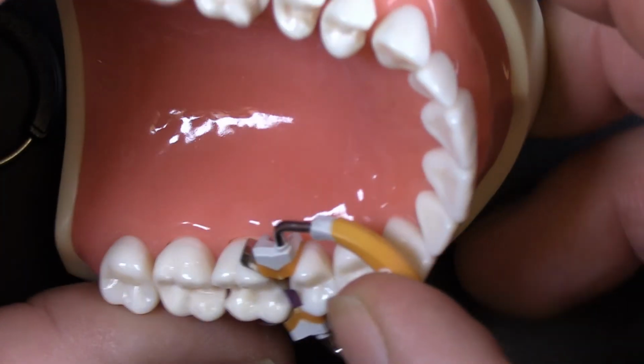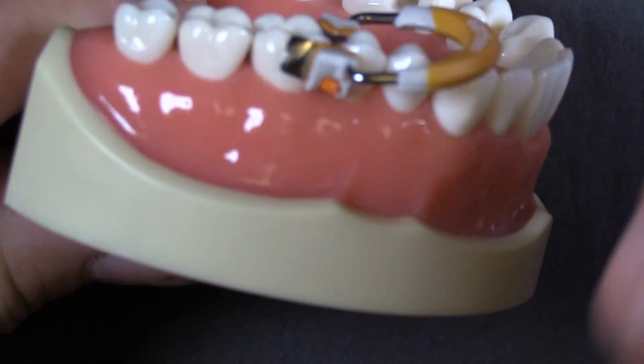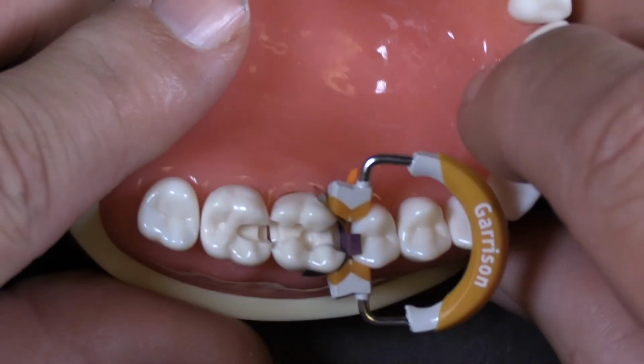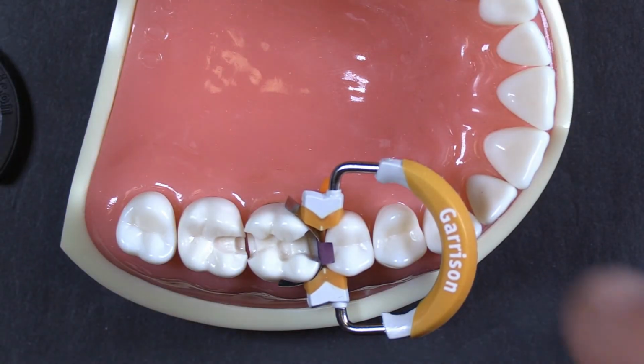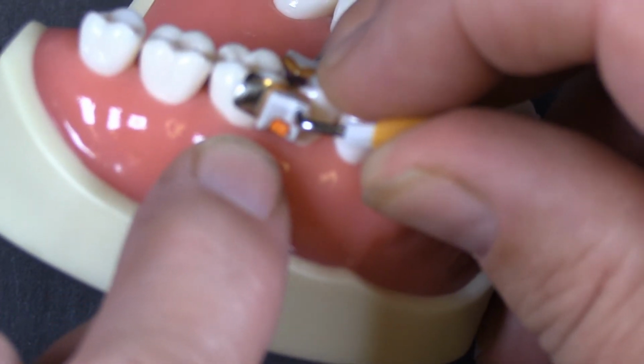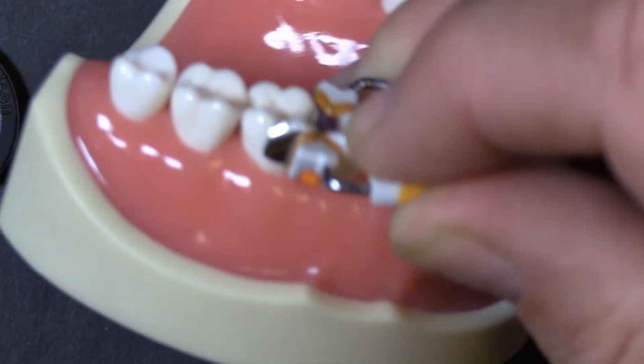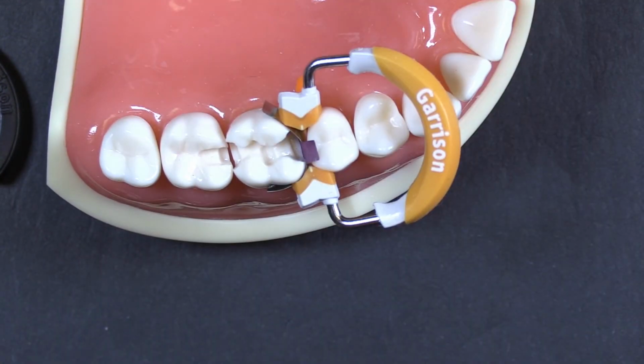If you're having continual ring popping off issues, you may not be seating your ring down as far gingivally as it can go. The patient's numb. If you go too far, you should bottom out on the wedge in the first place. You shouldn't be able to go so far down that you're pinching dramatically on the gingiva. If you do pinch the gingiva a little bit, they're numb. They shouldn't experience any discomfort with that.